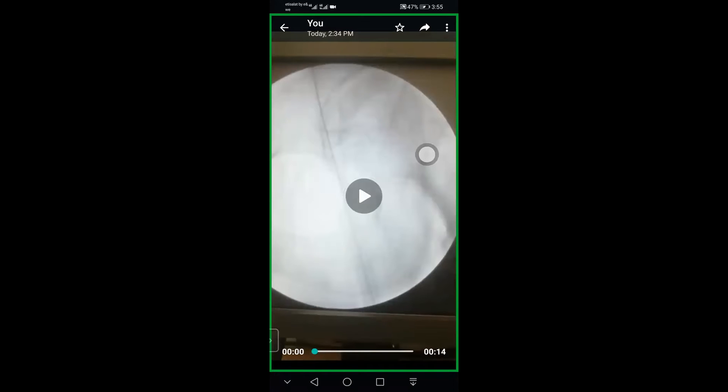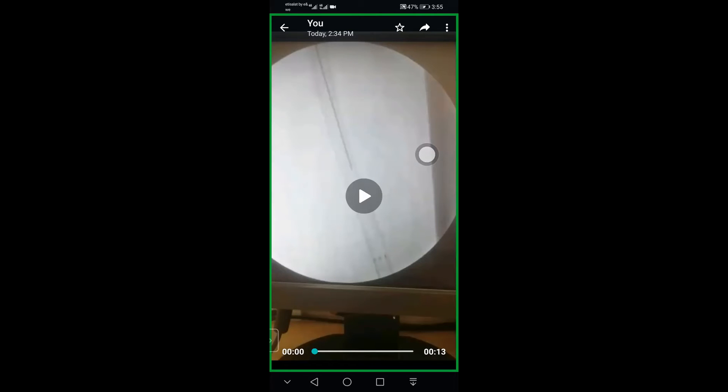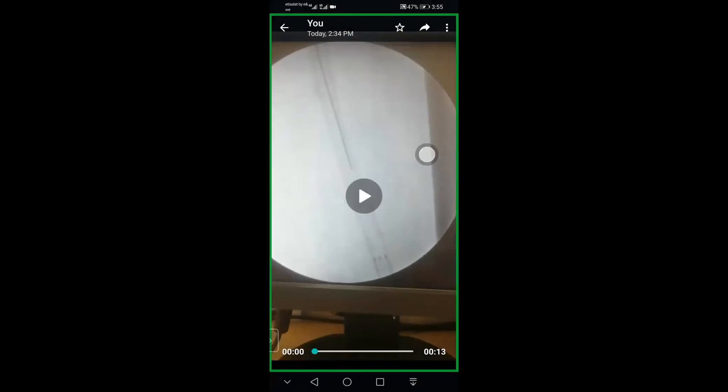It was very difficult to pass the wire in the normal way using this technique. That's why we decided to go directly through the lesion, not subintimally. After crossing the first stent and reaching the distal part, we advanced the catheter and managed to direct the tail of the wire — the sharpest part — straight into the lesion, not subintimal, and crossed the stent to be intraluminal.